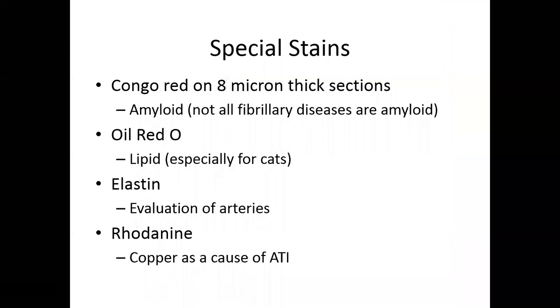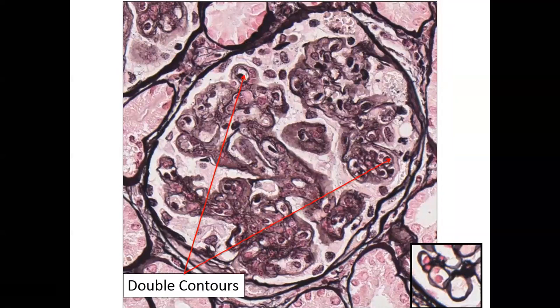Rachel, one quick question. You were going to talk about mesangial interpositioning. That can also cause double contouration, correct? Oh, yeah. So I should have said that. I incorrectly spoke when I said these are immune complexes. They often are immune complexes, but in addition to immune deposit material, they are also little extensions of mesangial cells that start here. So the mesangial cells are down here, and they make these cytoplasmic projections, and it kind of dissects in between the layers of the GBM, and so that also contributes to the double contour appearance.